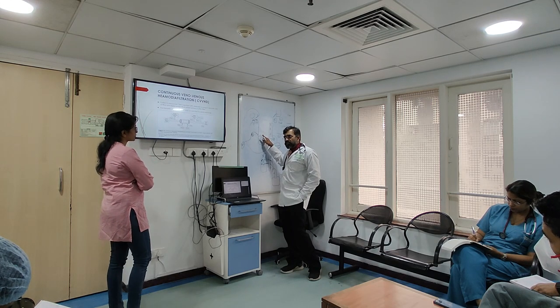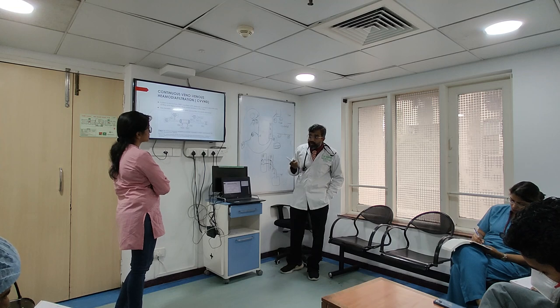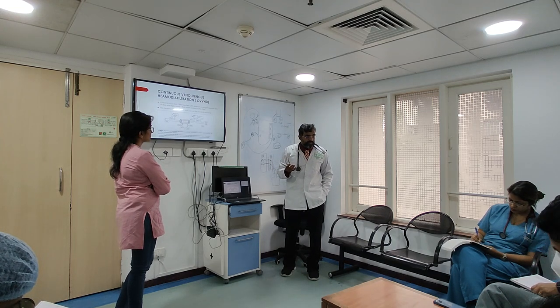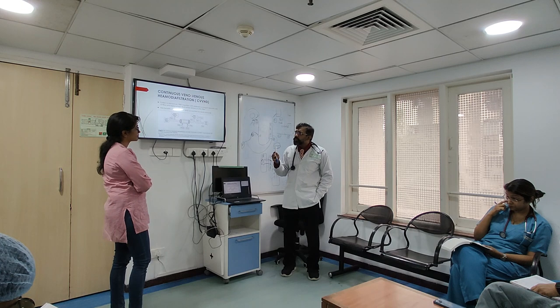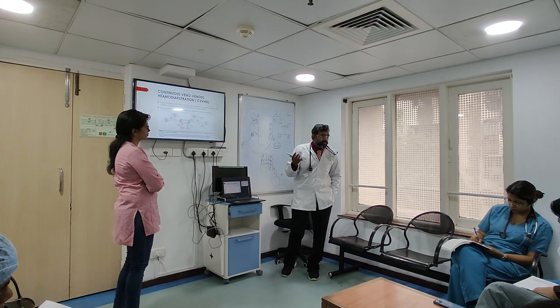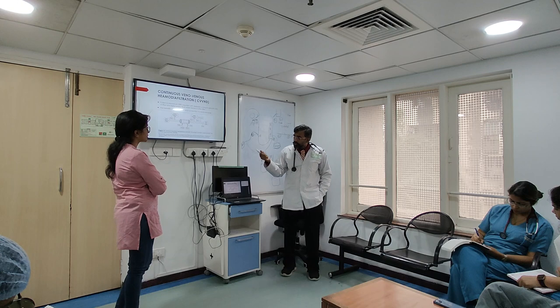And effluent pump and ultrafiltrate can go up to 100 ml per minute, 50 to 100 ml per minute. So you can give 2 liters an hour, 1 liter an hour is the ultrafiltrate. So classically most of these pumps are kept at 1000, simple to remember, and blood pump at 150 ml per minute.